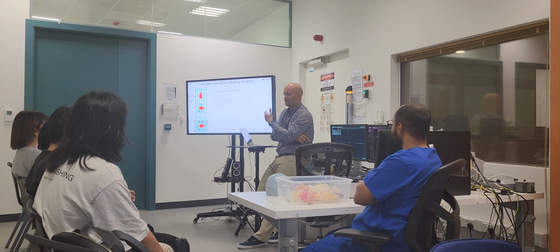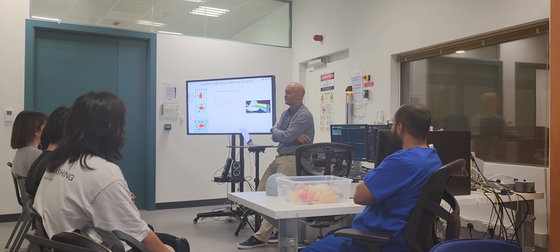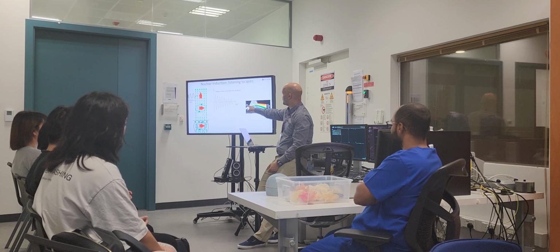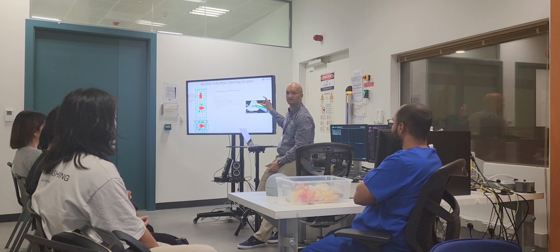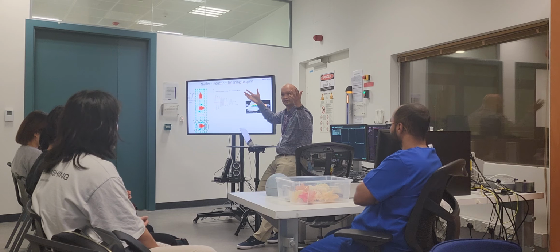I have a different way to explain Fourier transform. It's a mathematical prism that breaks my input signal into its fundamental frequencies, the same way a prism breaks light into its fundamental frequencies. You know what the delta function is? No, okay. White light has all the visible light frequencies. A delta function has all the frequencies. So white light is your delta function. What happens if I shine red light here? I'm going to come out with red light, because it's a fundamental frequency.